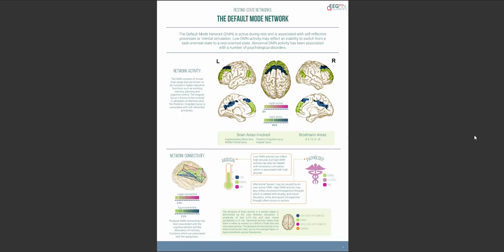In the bottom left part of the page, the network connectivity is shown. Network connectivity is based on the level of phase coherence between different brain areas. Hyper connectivity is shown in purple while hypo connectivity is shown in blue. The horizontal bars show the percentage of connections that are hyper or hypo connected.